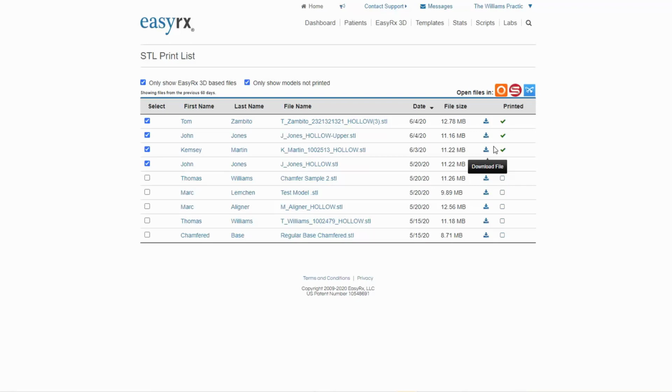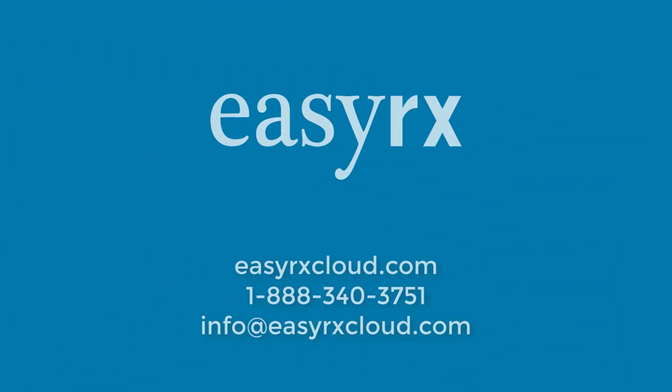EasyRx 3D is a very powerful application that's easy to use and cloud-based, allowing you to work securely from anywhere. EasyRx 3D is available on EasyRx 3D Standard and Premium plans, and also for our lab customers in Lab Standard or Lab Enterprise. Thanks so much for watching.